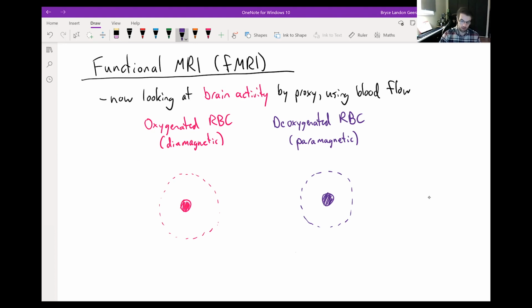Same with paramagnetic, but if we just draw some magnetic field lines, like you might see, I am just representing the strength of a magnetic field in an area. So, something like this. Actually, let me break this down quickly so that we know what I'm actually drawing here. Generally, a magnetic field is represented by these field lines that are describing the strength of the field at a given location. And these ones that are asymptotic at the top and bottom, stretching away, those are just even larger circles that we can't draw here.